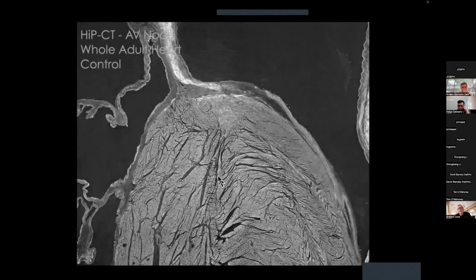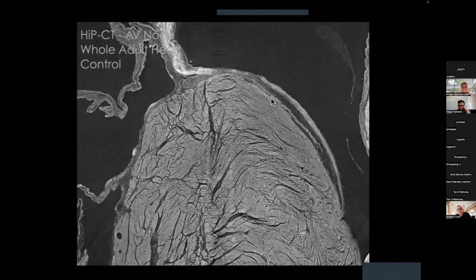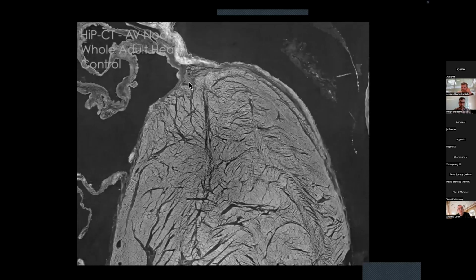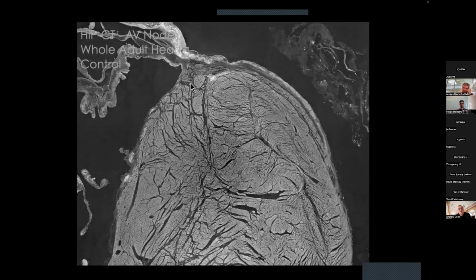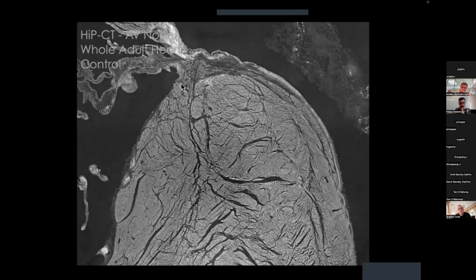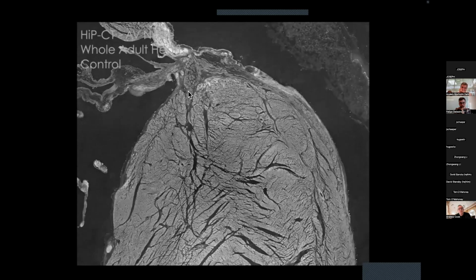I've created this video by going through the sections. Here's the left bundle branch, so that is slightly thicker. And then hopefully we'll begin to see the right bundle coming off. And again, it's very subtle. So you'll see a strand coming down here, and then it begins to condense and become more of a cord-like structure. So it's a bit sheet-like at this stage.